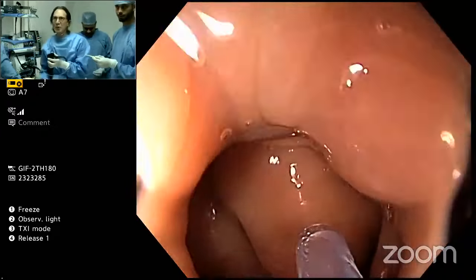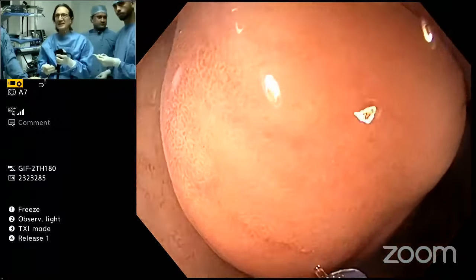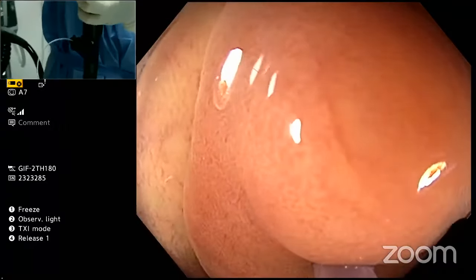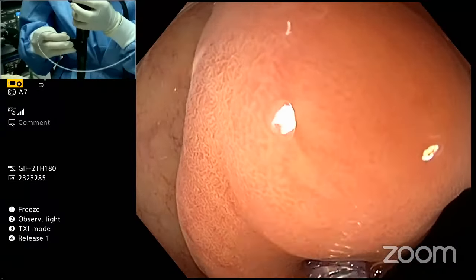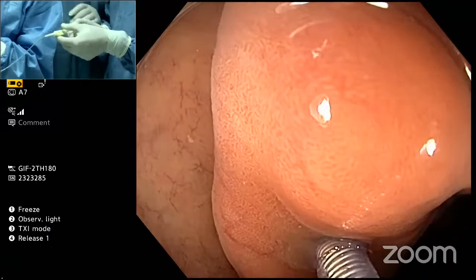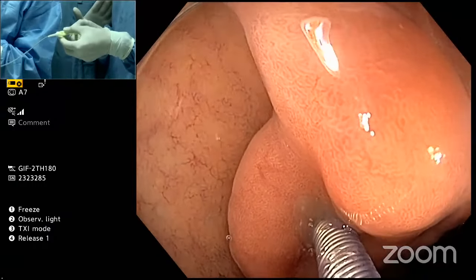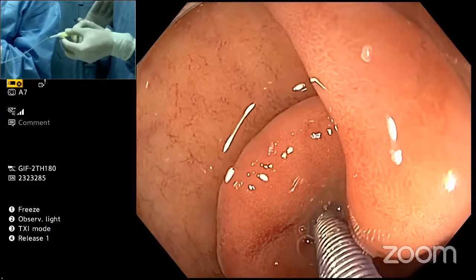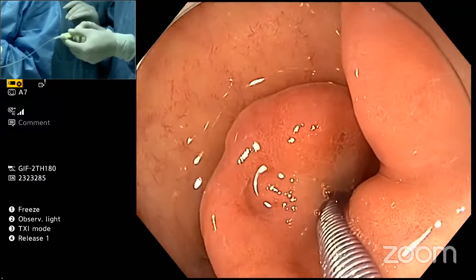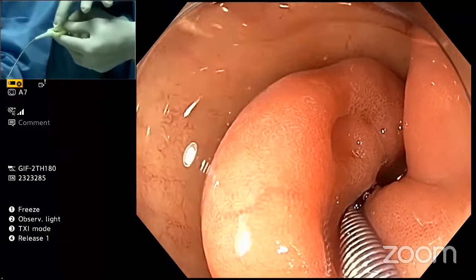All right, now I'm going to push in now, and then I'm just going to rest this up against this like this, just gently. All right. Assis, I want you now, you're going to advance this forward. All right, good. Just advance it. And now you're going to turn here. Slowly turn. You want to drive it in, slowly, torquing. It's going to dig into the tissue. Now it's already starting to twist the tissue a little bit, like that. And that may be actually enough. Why don't we stop now? And now all you do is you pull back. Pull back, and it dislodges it.